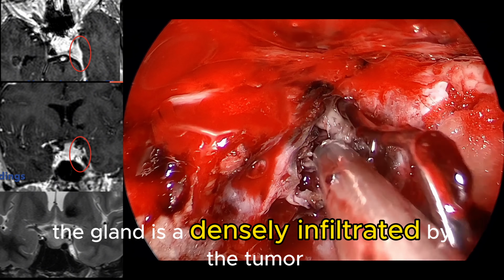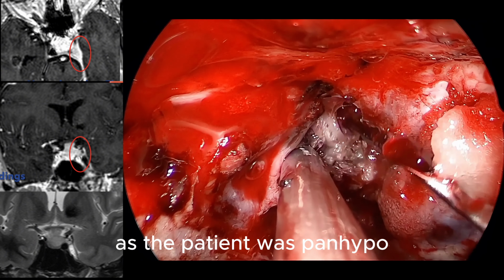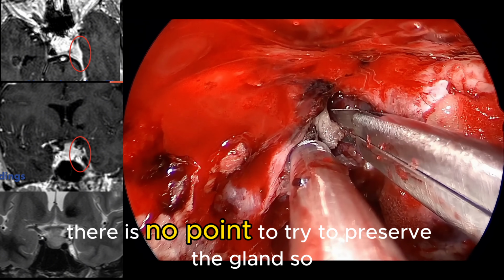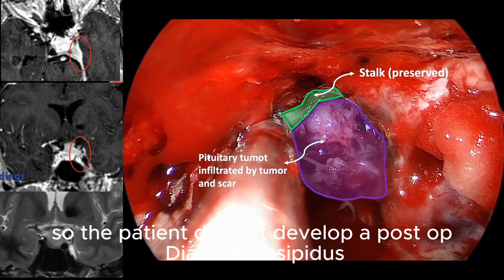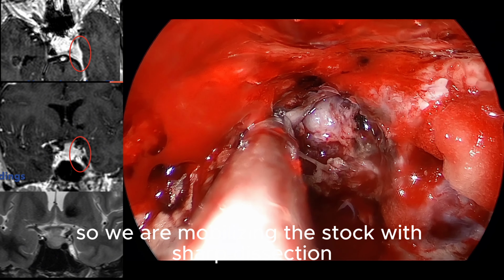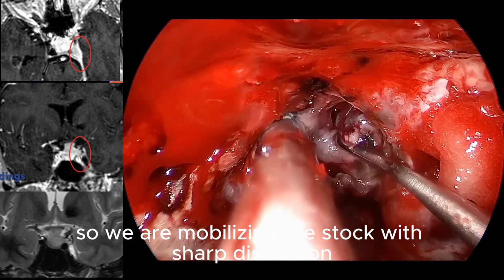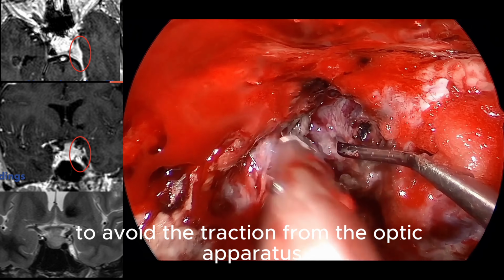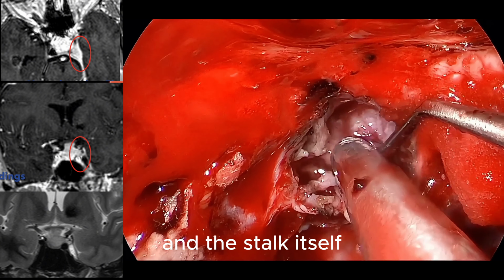The gland is densely infiltrated by the tumor, as the patient was panhypo. There is no point to try to preserve the gland, but it's important to try to preserve the stalk so the patient doesn't develop a post-op DI. So we are mobilizing the stalk with sharp dissection, and we bring the tumor down to avoid the traction from the optic apparatus and the stalk itself.